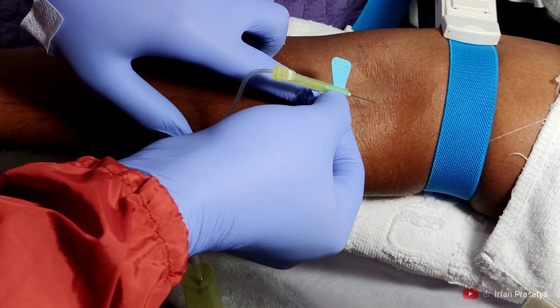Di konten ini saya bukan ingin memperkenalkan — ini akan kembali ke bagaimana masing-masing dokter melakukan tindakan tersebut dan skill masing-masing dokter. Ini merupakan insight, nice to know saja, saya mau berbagi ke kalian. Buat saya pribadi, saya lebih prefer untuk menggunakan metode vacutainer, yang menggunakan vakum ini.